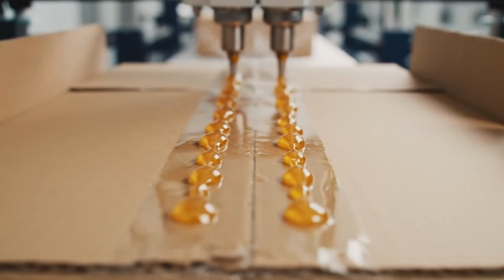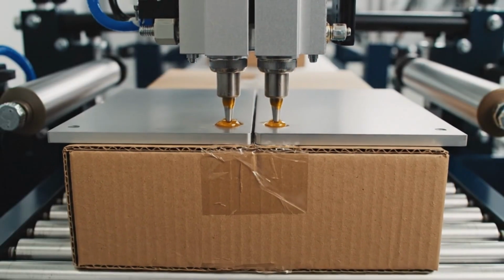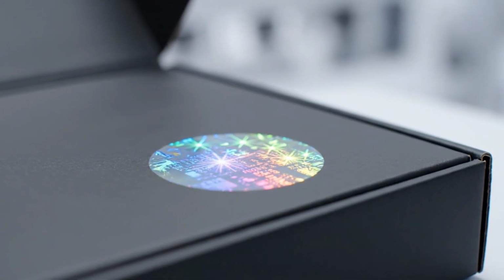Tamper-evident sealing ensures that the product the customer buys is exactly as it left the factory. Our brand is a promise of safety. The hologram is the visual proof of that promise.